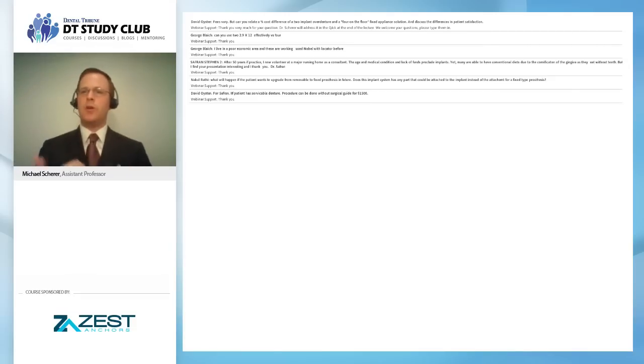So what's important to understand here is that the general recommendation is that when we have a torque value of higher than 70 Newton centimeters, we tend to overload the implant-to-driver interface. And these implants have been engineered to fracture at around 120 Newton centimeters, or maybe just shy of that. So what I don't recommend doing is just testing that, because it is an external hex implant. It won't flower, but that head will break off. I don't recommend going above 70 Newton centimeters.